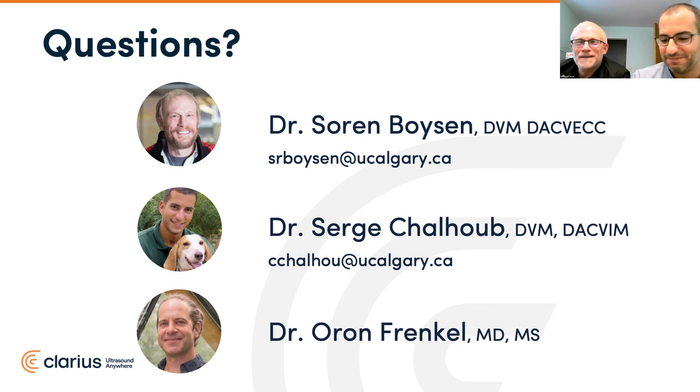But yes, exactly the same questions are asked and answered. The protocol is identical that we use in our cats as in our dogs. I just wrote a chapter for a group in Massimo, and he's got a book coming out just on feline emergency critical care management. And we wrote the book chapter for that too. Exactly the same protocol in cats as dogs. But like Sir said, things are smaller, so your movements are more subtle. Otherwise, it's the same.